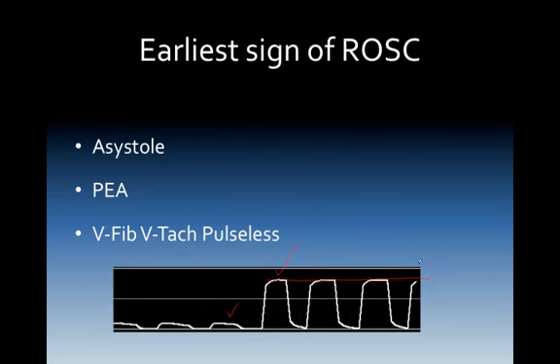So watch your capnography the best you can. If you see an increase in end-tidal CO2, very simply, you could have just had an ROSC. Finish up your 2-minute cycle and then check for a pulse.